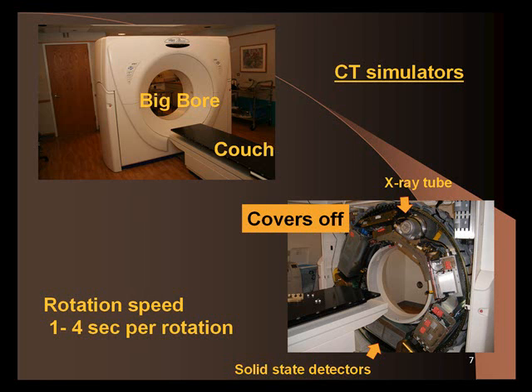So we need to encompass the entire pelvis inside the field of view to have this external surface for treatment planning, because we need to know the entire depth for our calculations. If we only have part of the patient, the depth is going to be less than we think it is.